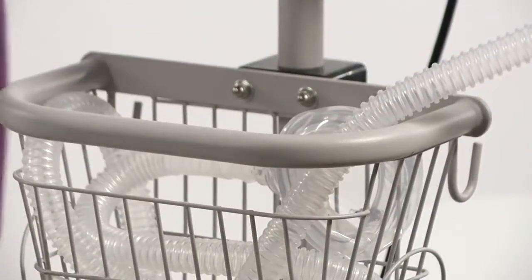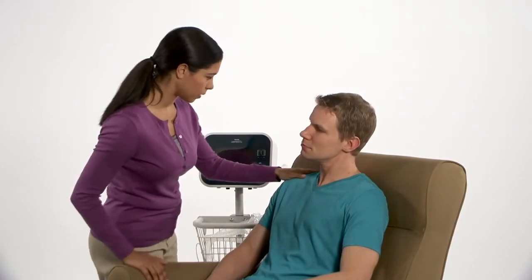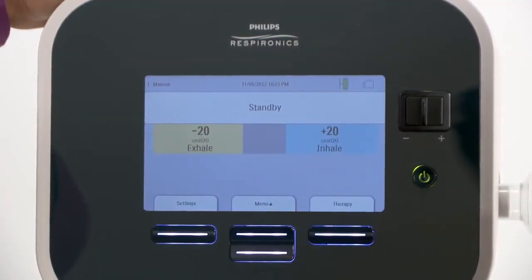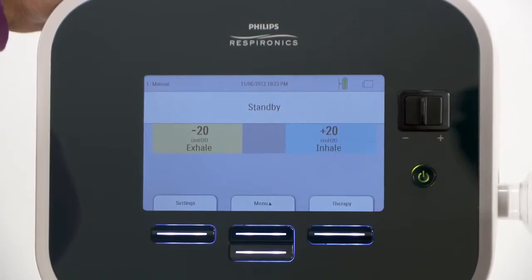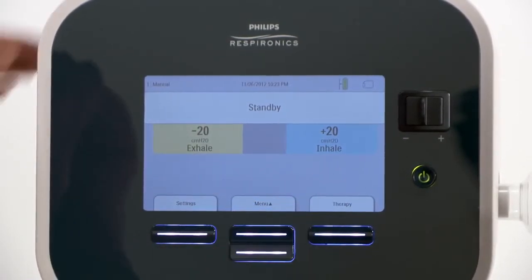If the trach has a cuffed tube, inflate the cuff. Help the patient into as upright a position as he can tolerate. Press the round Start-Stop button on the front of the CoughAssist E70 to enter standby. If the device is running on AC power, the button will illuminate. Check the treatment settings to make sure they match the doctor's prescription.